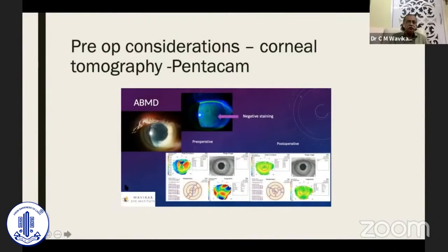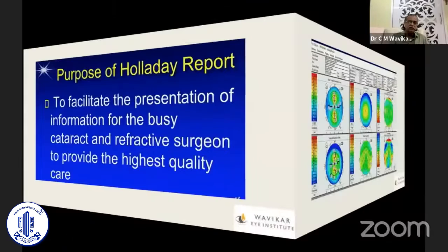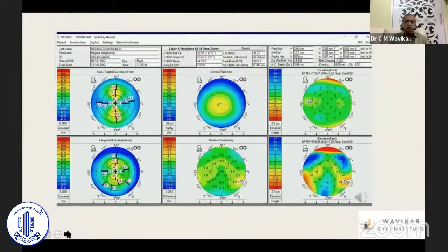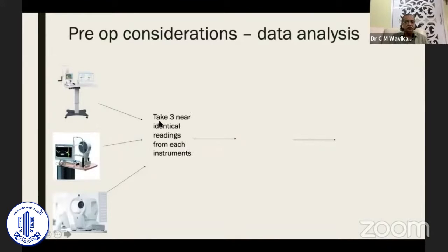This is a case of ABMD which was missed and the patient had a surface issue — just as an example. For post-refractive surgery cases, there is a Holladay report on Pentacam which is of very high value: in one screen you get everything required for post-refractive surgery cataract and astigmatism calculation. We need to have three instruments, each giving three nearly identical readings. If reproducible, select one and compare them.